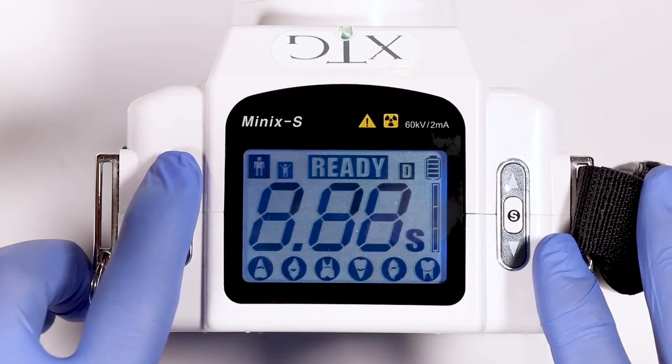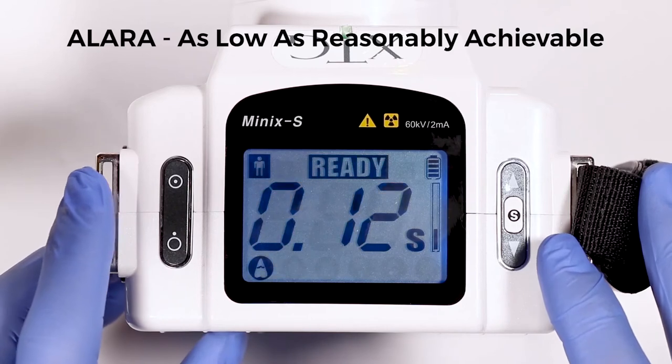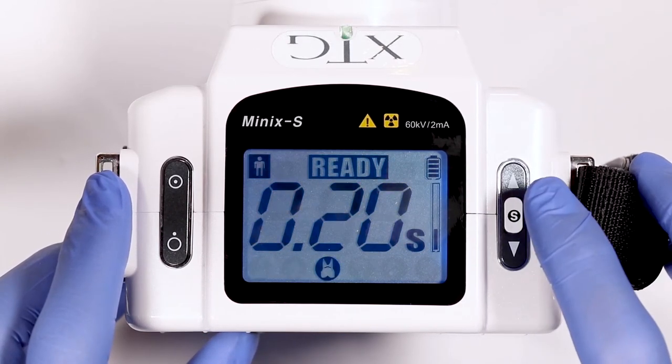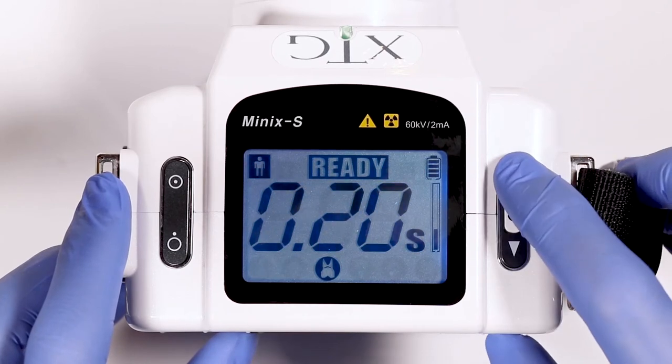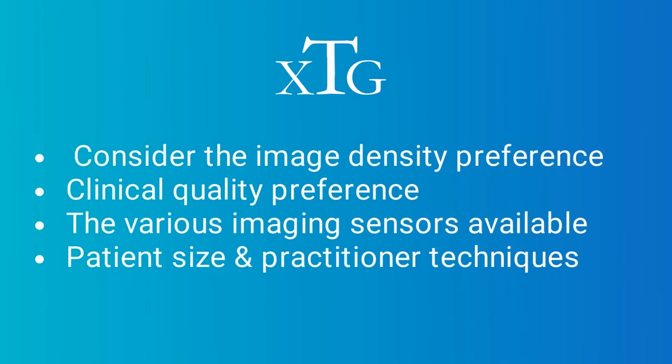Deciding on the appropriate time settings, remember the ALARA principle, or as low as reasonably achievable. This means to set the exposure time as low as possible while still achieving an appropriate diagnostic exposure. There are several factors to consider when choosing an exposure time. Consider the image density preference, clinical quality preference, the various imaging sensors available, patient size, and practitioner techniques.